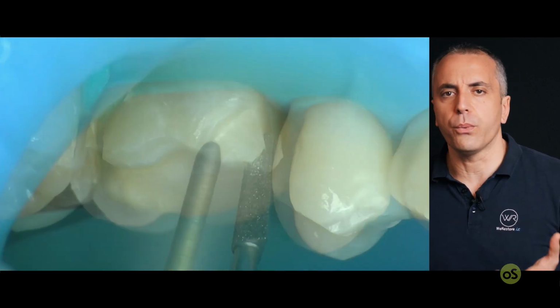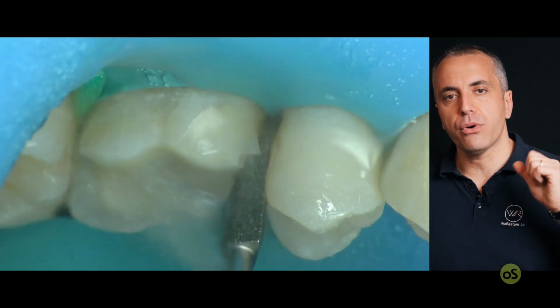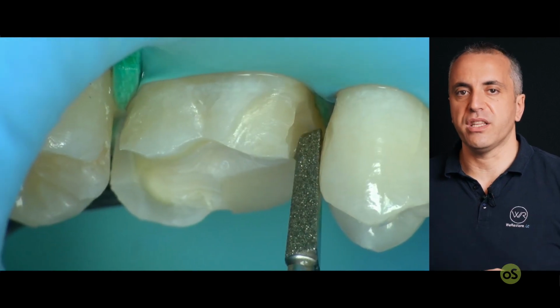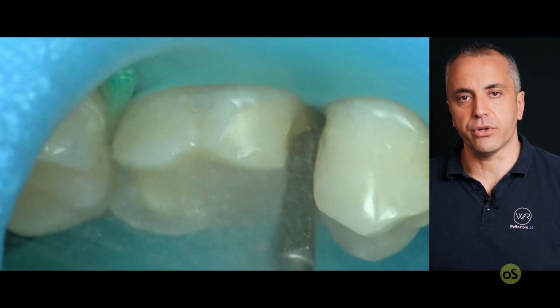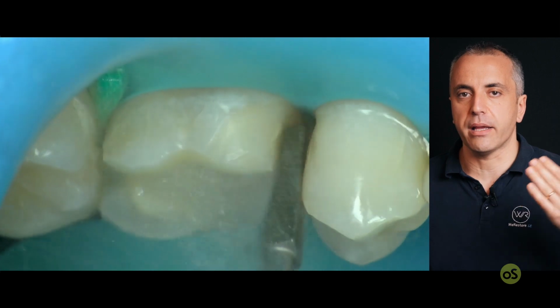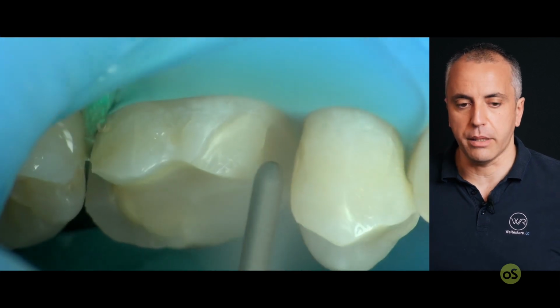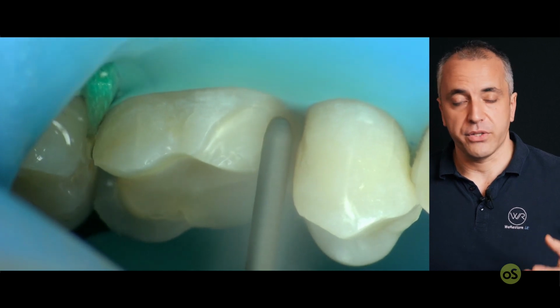Of course, a flat one will work very well, no problem, but this allows more surface of enamel, so a higher surface for adhesion, and then it also blends better from an aesthetic point of view, because some patients, while smiling, also uncover the mesial part, the buccal part of the first premolar, the first molar, sorry.